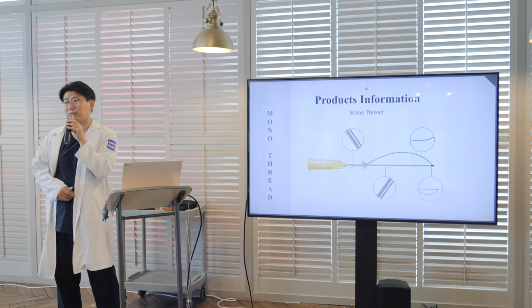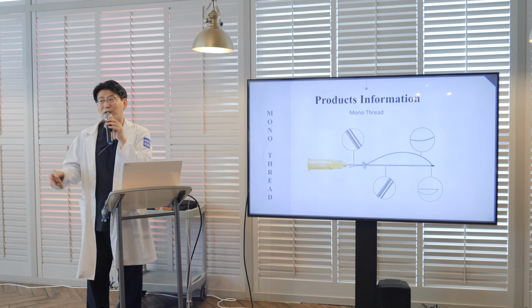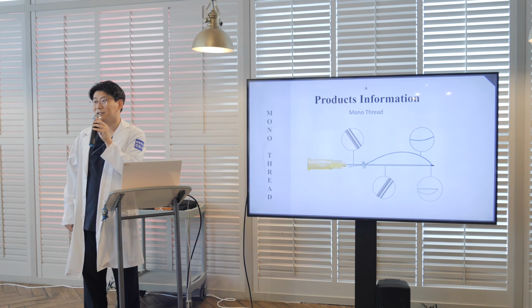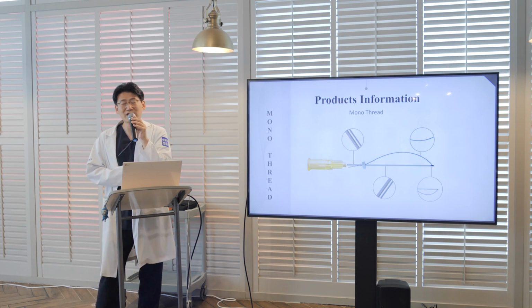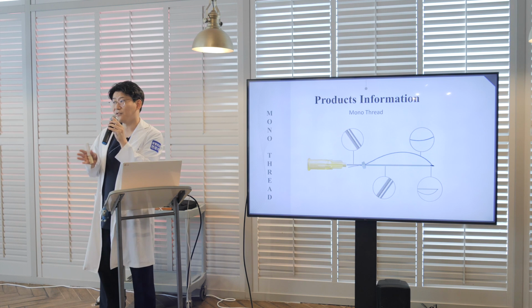This is mono thread. I don't have to explain about this because we are using this all day. As we know, it's very simple, but very useful. But we have a lot of developed threads nowadays, and the effect of this thread is very limited. And as we know, it's also loaded on a shaft needle.